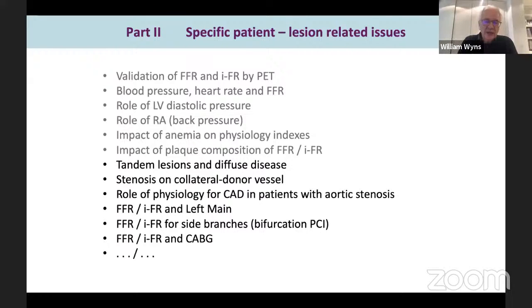Well, I suppose AFib is okay if it's reasonably controlled. Don't forget that we are not measuring one beat. Depending on the setting of your machine, you're going to average the measurements on 3 to 5 beats, for instance, for FFR. So there is already some averaging. By bigeminy, I'm not sure what we can conclude from that measurement, I would say.